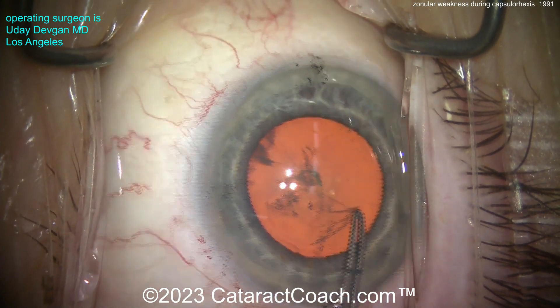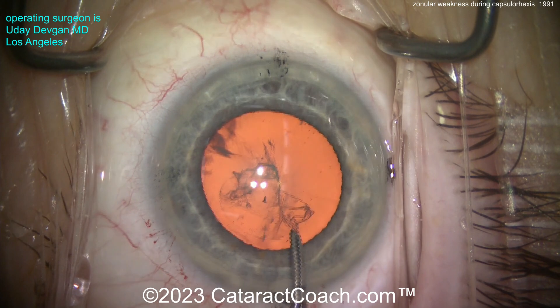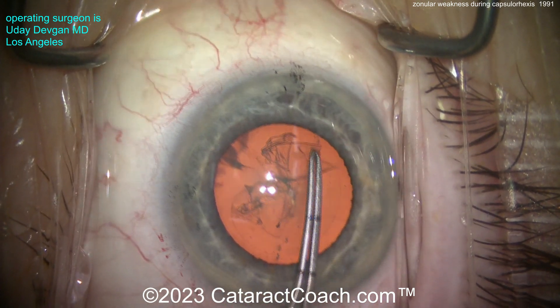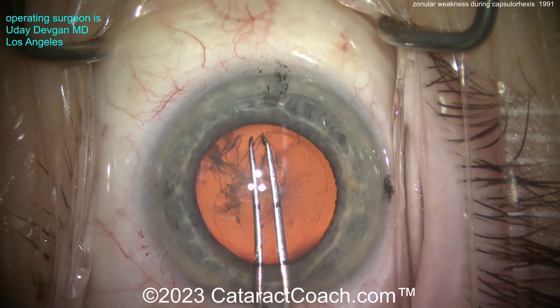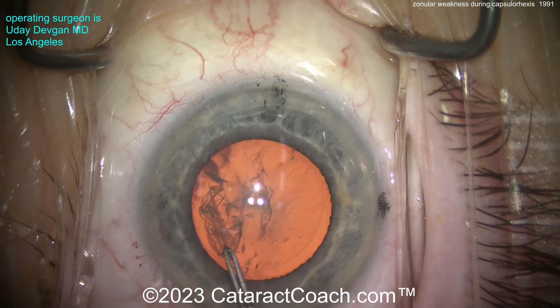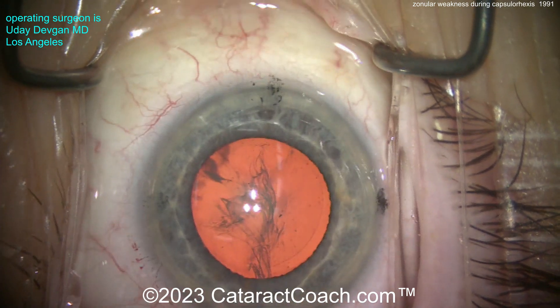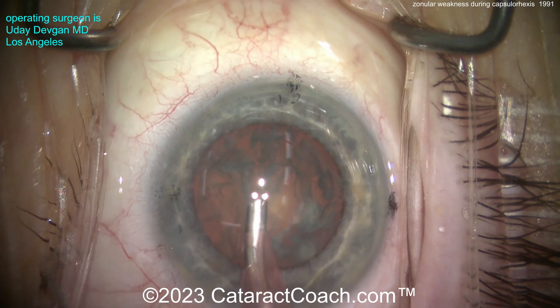Now I'll get that good solid 5mm rhexis. The pupil is just slightly larger than 5mm. You can see marks on the cornea, meaning we're going to place a toric lens. During the rhexis creation, there's not a whole lot of wrinkling of the lens capsule. So there is some zonular laxity, but it's not terrible.